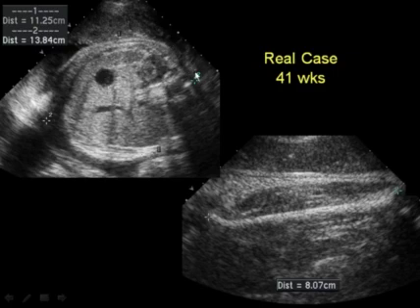You really can't see where the edge is posteriorly behind the spine. And again, the anterior mark is somewhere in this black, not an accurate location. And notice these measurements are 113 millimeters to 138 millimeters. This is way over the 10 millimeter cutoff and tells me that this is a very oblique measurement and probably not accurate. Looking at the femur length, we don't have the sharp, crisp ends at each side that would help us know that it's an accurate measurement.